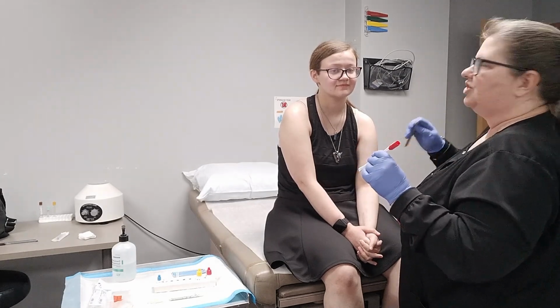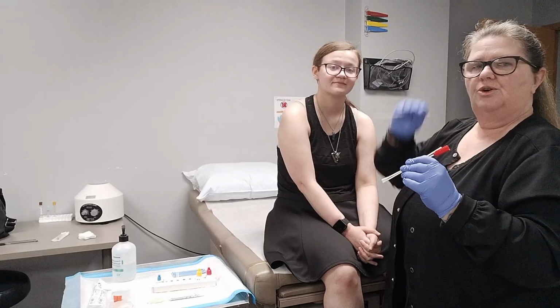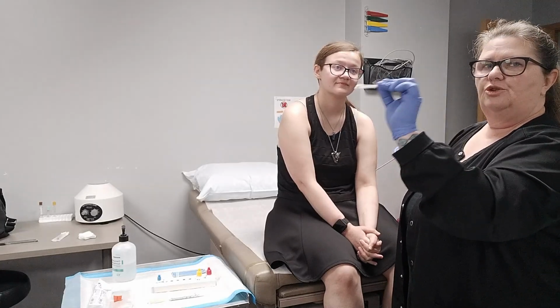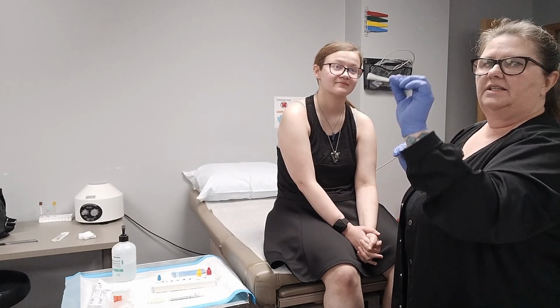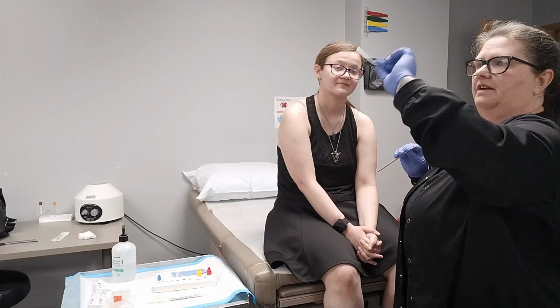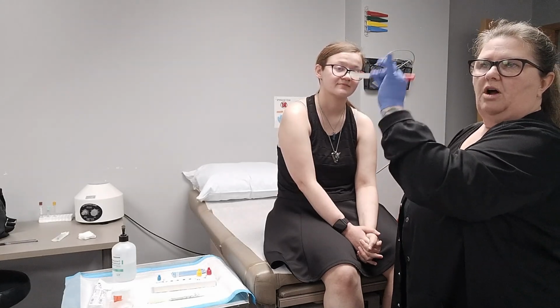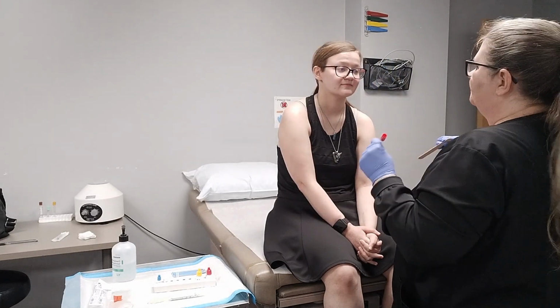Now, once she has her mouth open, I have the tongue depressor holding her tongue down, and she has said ah, I am going to stick this into the back of her throat and quickly take a little bit of a swab, and in kind of a figure 8 motion, another little bit of a swab off of both of her tonsils. Are you ready?